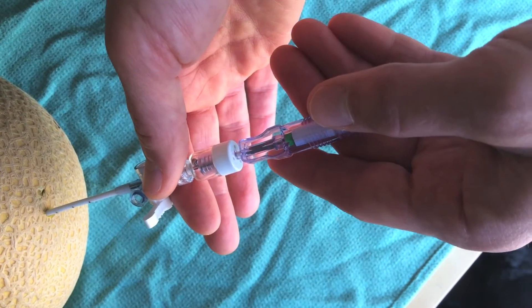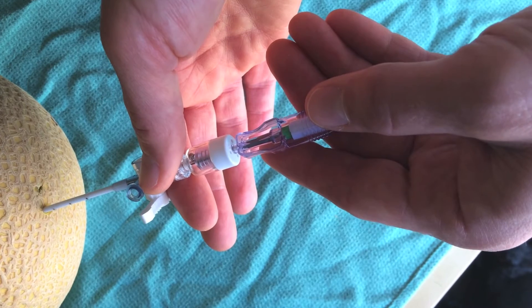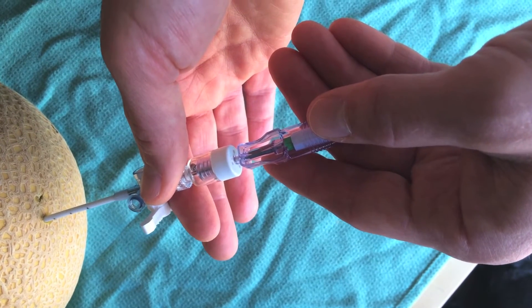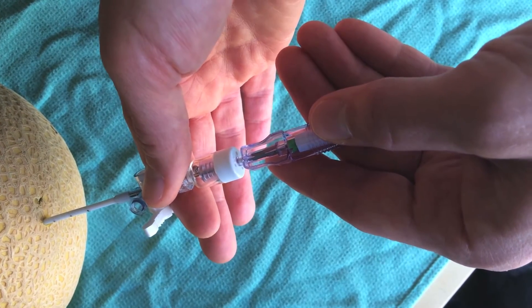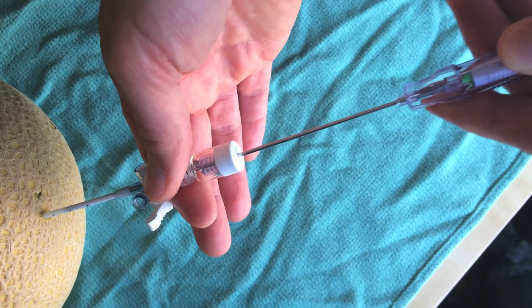The next step is to remove the needle leaving the catheter in place. Hold the catheter just above the stopcock and remove the needle. You can then discard it.